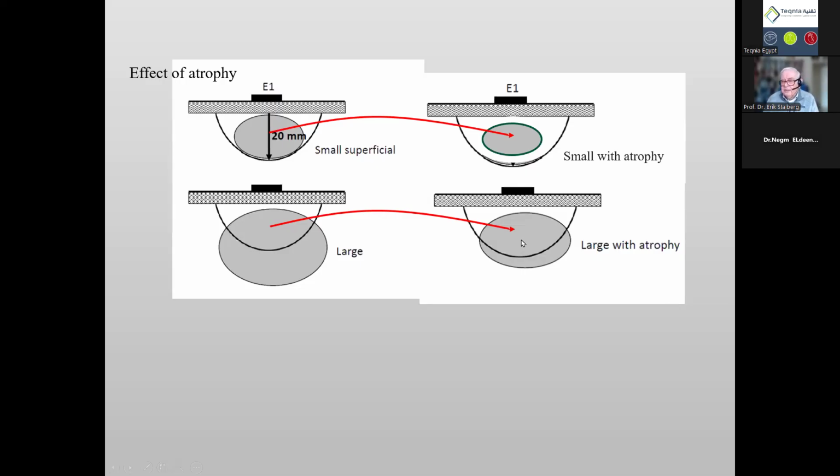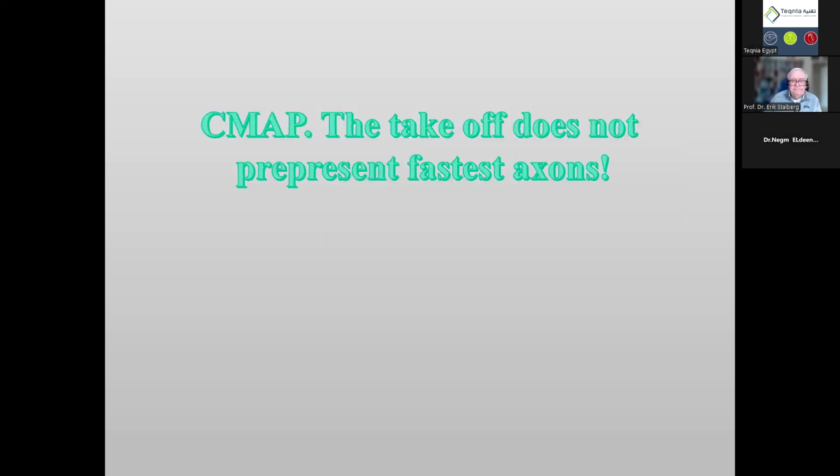And also this is the reason why we do not have so big changes in amplitude between children and adult muscles, because in children muscles we see the whole muscle, and in adult we see only a part of that muscle. So this is new thinking and can explain if you have been thinking, why is there so little difference in the early age and the later age?